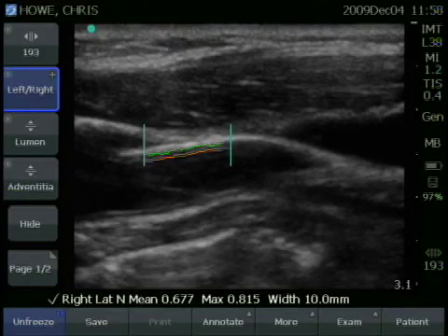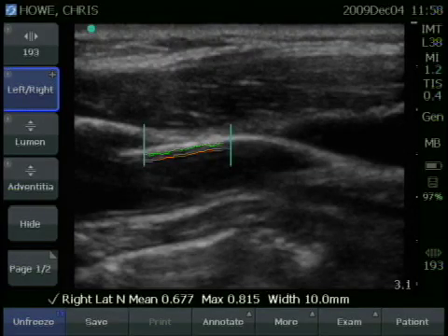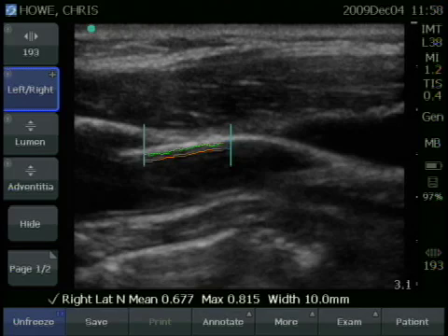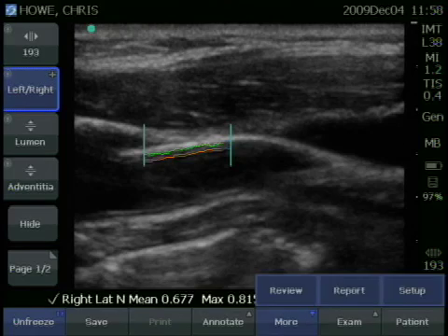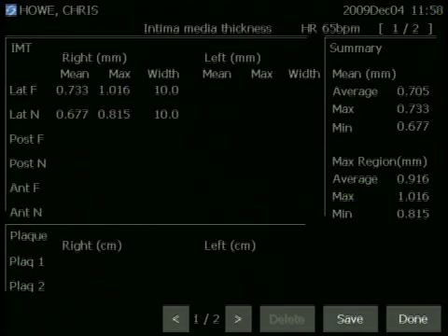When you acquire your measurements, it's important to remember to hit the save key so that those measurements will be populated in the report page. To view your report at the end of the exam, select the more key and then report, and all measurements that have been saved will be populated in the report.